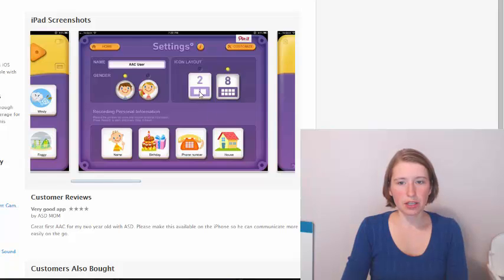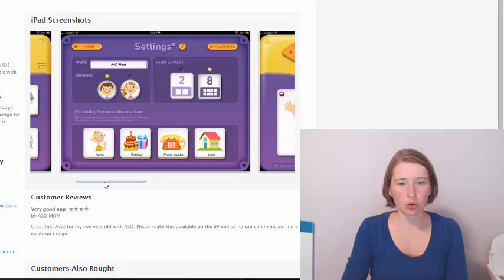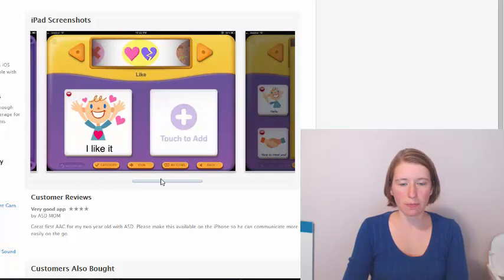You can have two items per screen, or you can have eight, which makes it really good for the children that need fewer choices right there. That's a good option for them. You can put their personal information in there. So it'll say, hey, my name's Joey or whatever.